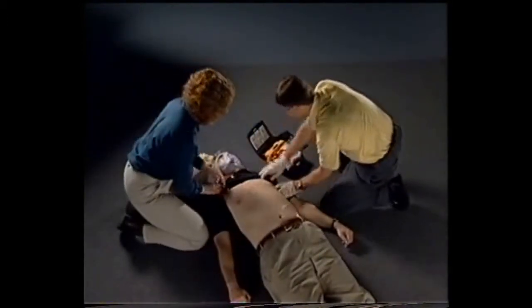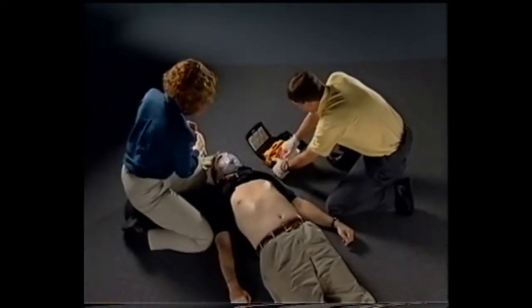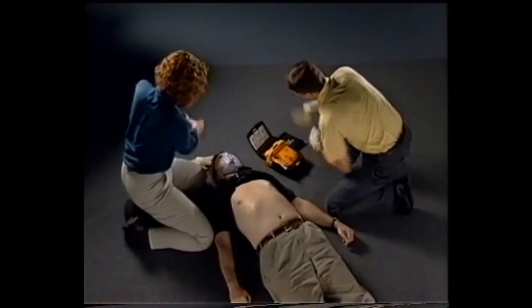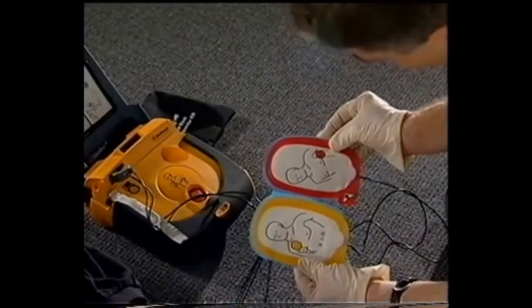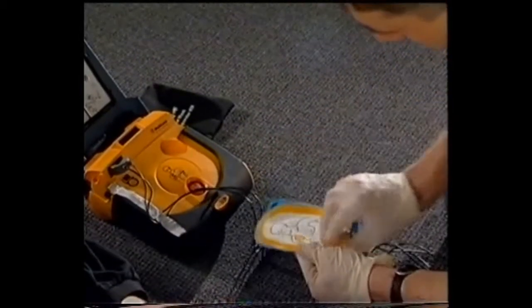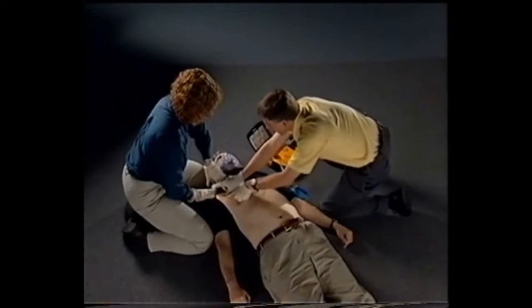Next, you need to place electrode pads on the patient's bare chest. Pull red handle to open bag. Peel each pad off blue plastic. Look at the pictures on the pads to see where to place them. Apply pads to the patient's upper right chest, just below the collarbone and above the nipple.